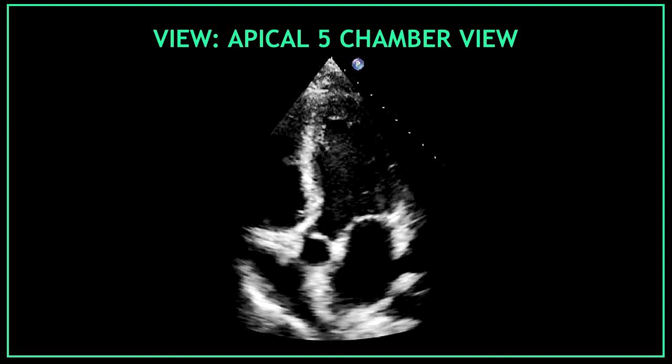The next view is the apical 5-chamber view. Now I'm going to show you one by one all the minimum dataset you need to obtain of the apical 5-chamber view.